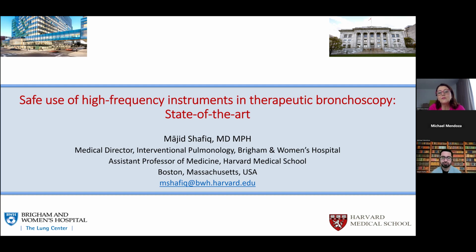Another question for cryobiopsies for interstitial lung disease: do you use the 1.1 or always the 1.9 cryoprobe? Yeah, with the new single-use disposable cryoprobes that have come out now, I used to use the 1.9. At the moment, I'm really mostly using the 1.1, and I found that it's really useful. There's of course the theoretical advantage that it's smaller, so hopefully its depth of effect is smaller, and you have a lesser chance of freezing a major vessel and then rupturing that, which is great, or a major airway.